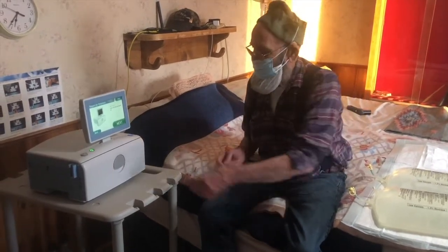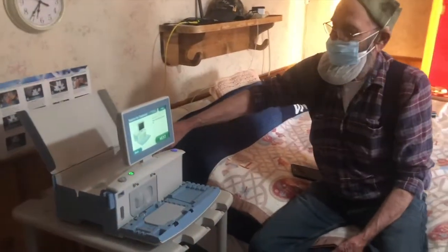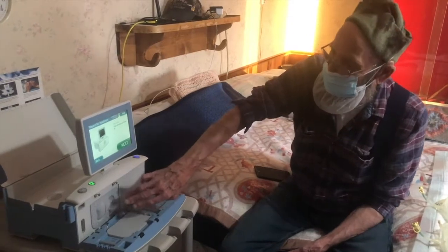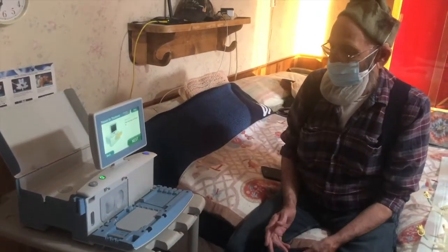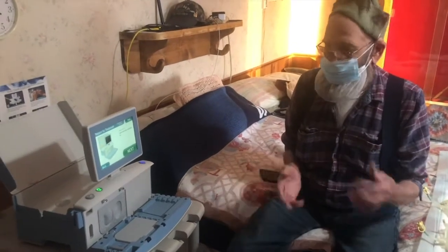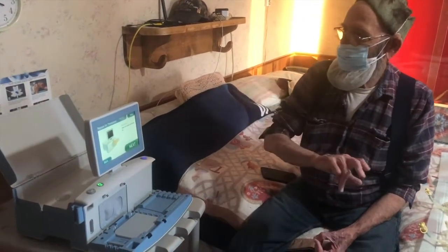Now open the front door and heater lid. This is the front door and the heater. This is where you put your solution bag in there to heat it up. This little thing here is a pump that does all the transfers. It opens and closes valves in this cassette that makes everything work right. So it's just magic. So we got the front door and the lid open.